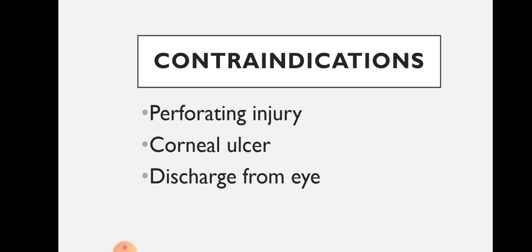If the patient has any type of infection in the eye that you may not know about, and without cleaning properly you use the same probe on another patient, then there can be a risk of infection to that patient. So don't forget to clean the probe after every use, whether contact or immersion.